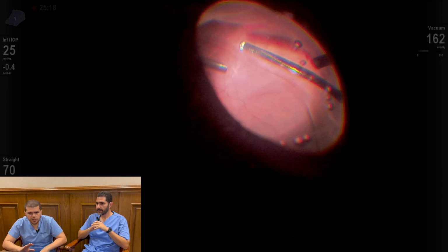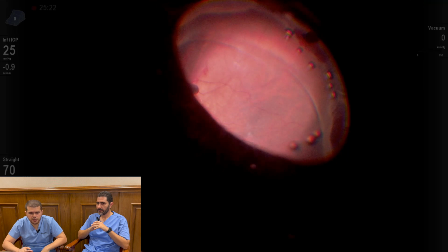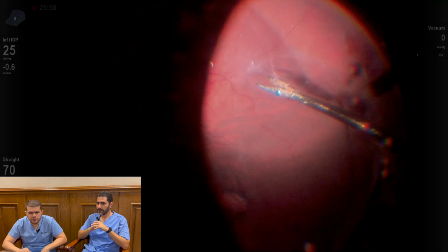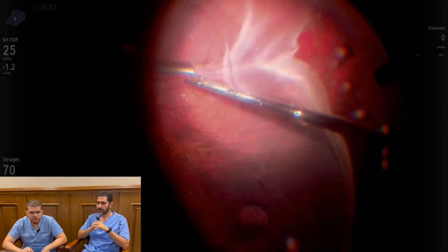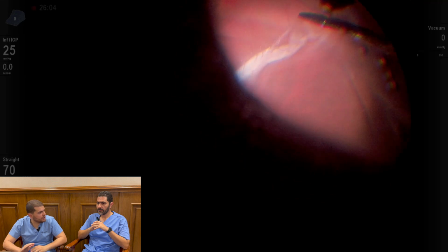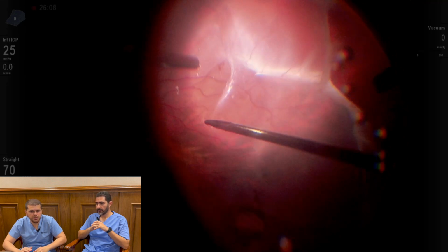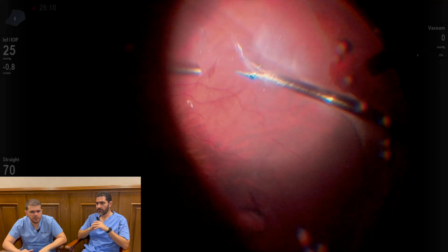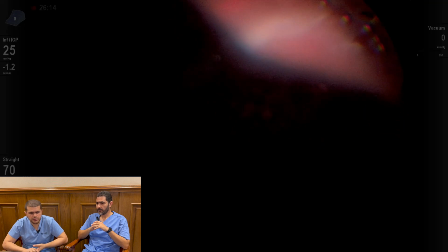Yes. There is one area still in the inferior part where there is an attached posterior hyaloid. And we will notice here that as I'm pulling, there will be a spot of hemorrhage from the pull. Again, you would continue and not stop, because if you stop here and leave this amount of vitreous, there's a higher risk of recurrence, right? Yes, even if hemorrhages happen or anything happens.